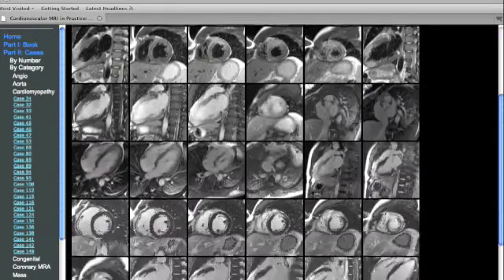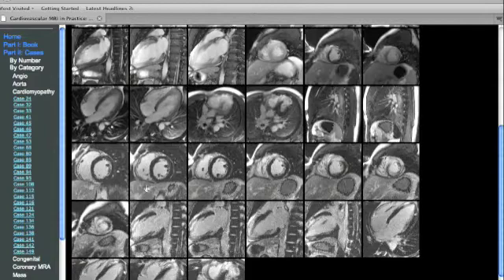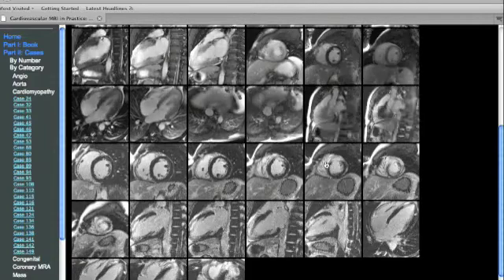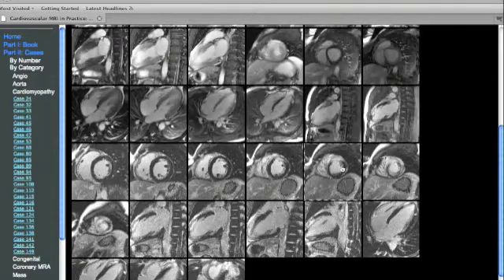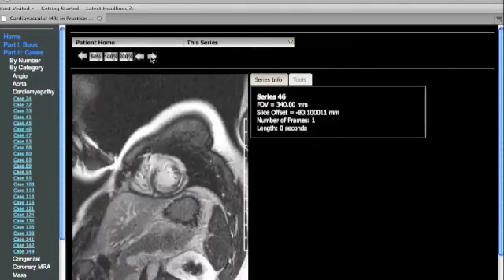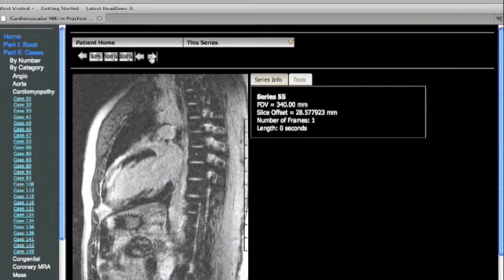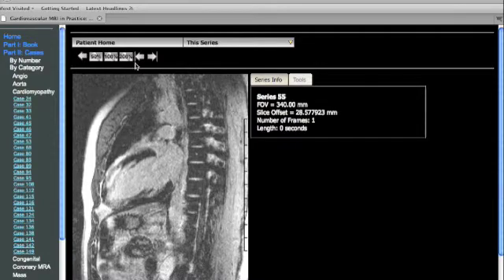Here again, we have a short axis view showing the anterior wall uptake extending to the apex, and then the two-chamber view confirms the extensive uptake with sparing of the apex.